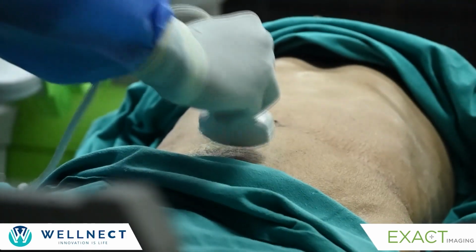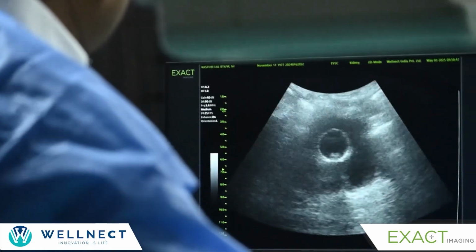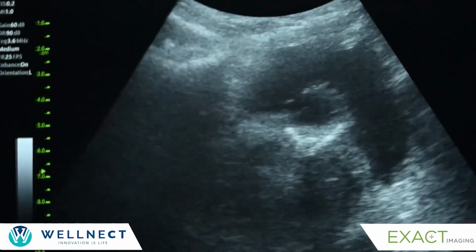Now you first see the bladder in transverse section. Can you appreciate the prostate and the bladder? So this is the prostate. Okay, this is the prostate. This is the balloon that you can see, and this is the bladder.